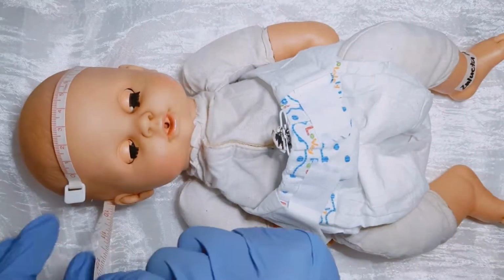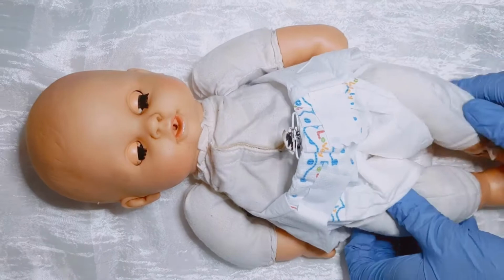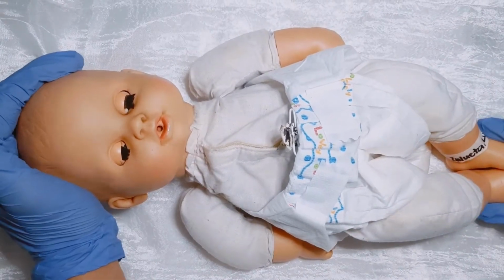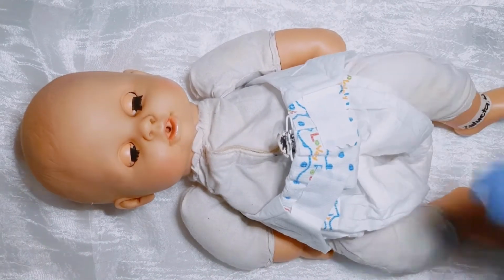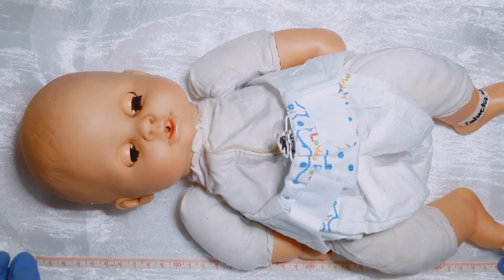And now I will be completing the general survey by getting the length, head circumference, chest circumference, weight, abdomen, obvious deformities by using tape measure and the weighing scale.